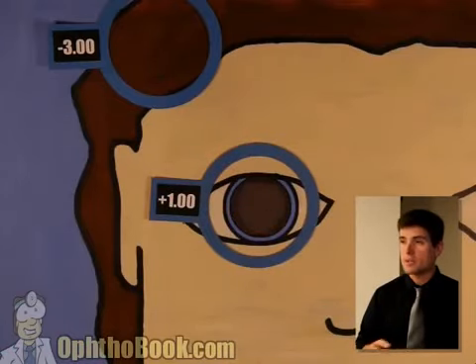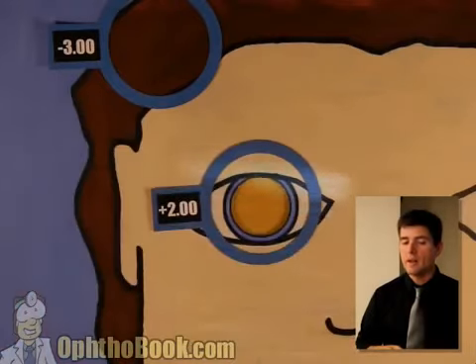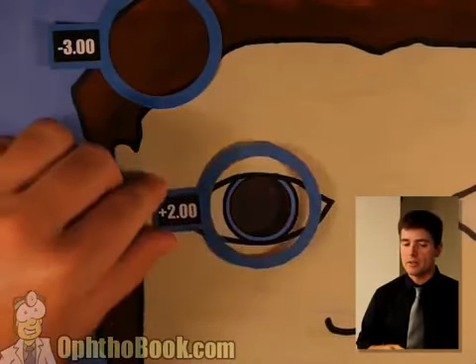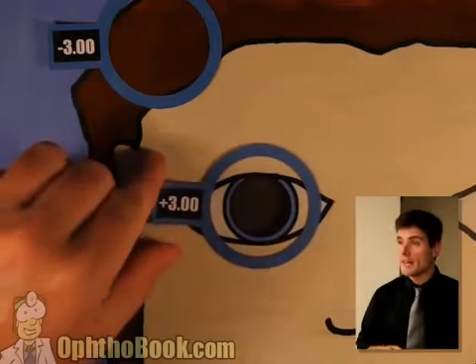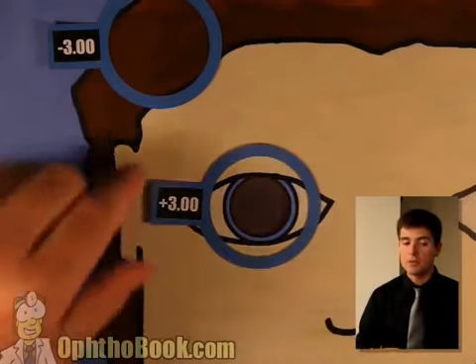We may have it. This person has a ton of astigmatism. +2. Let's try it. I think we got it. This looks like it's our answer. I'm getting greedy now. We're going to try a +3. We've gone too far. So the answer was a +2.